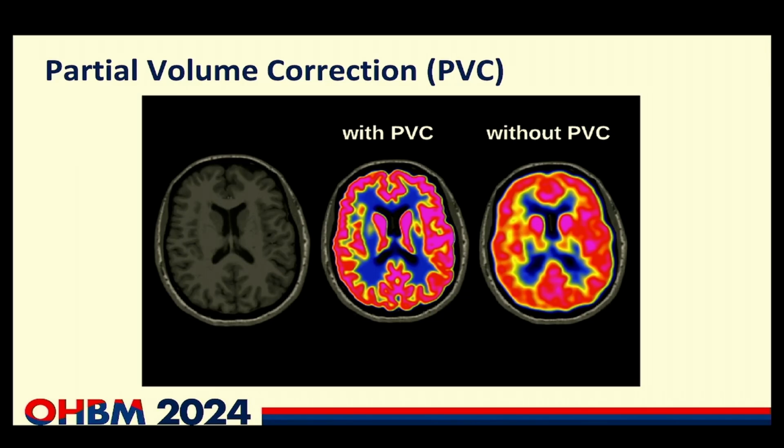It's a necessary evil when we have diagnostic groups where we have, for instance, cortical degradation or different region sizes. Basically, it ought to improve our data, but these algorithms are not exact. They don't perfectly solve things. So just for everyone's understanding, partial volume effect correction is something that we do when we need to, but until we have better algorithms, we tend to avoid it if we can.